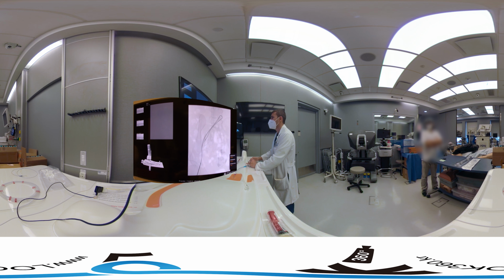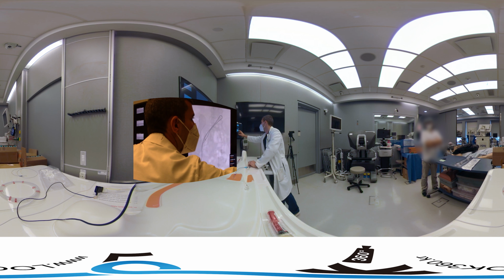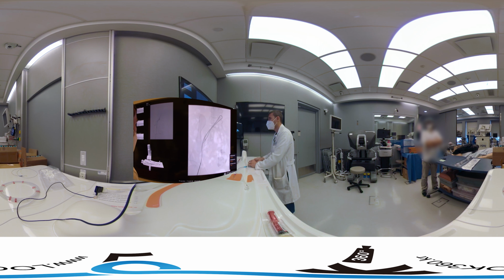We get to something slightly different position. What we'll do is maybe change some of the characteristics of the wire or the catheter in order to give us a little bit better position there. So we'll try a slightly different angle here, and that might give us a little bit better position to get into this branch. We'll push down a little bit.